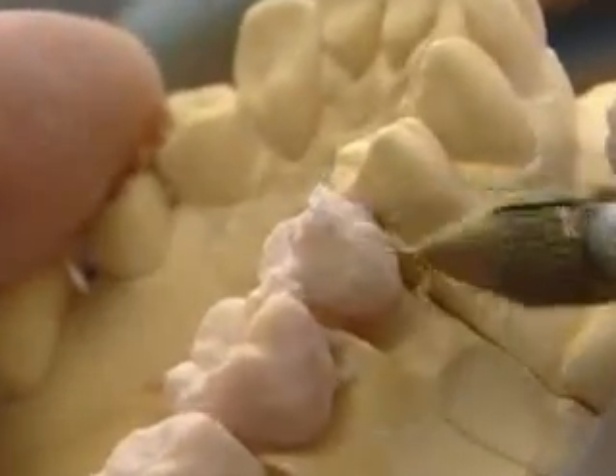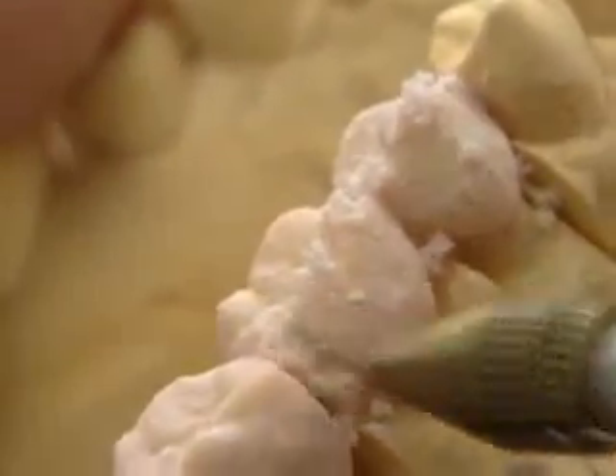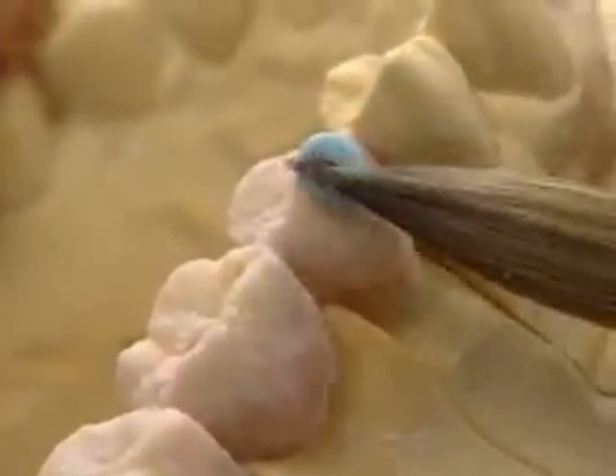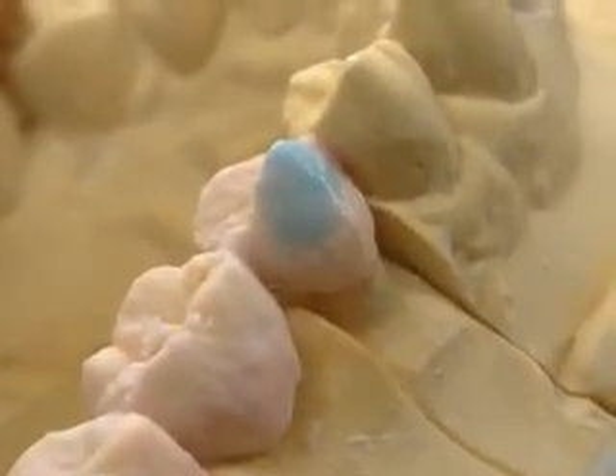With Nobel Rondo, zirconia ceramics can form enamel layers of a natural thickness. The highly compact enamels and opal enamels mixed with Nobel Rondo soft liquid are extremely homogeneous and can be applied as desired.